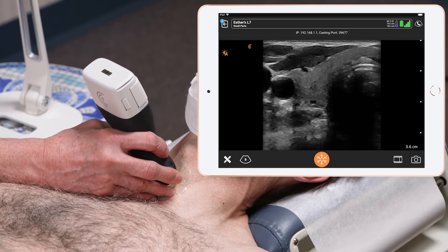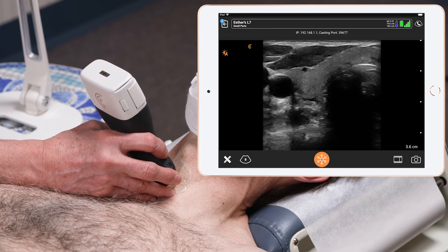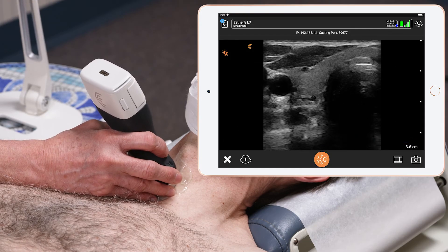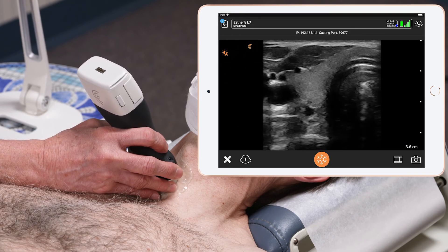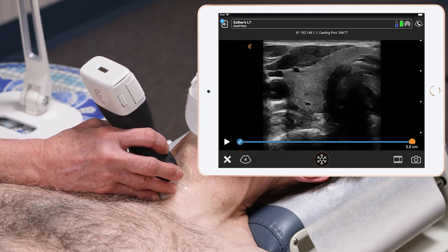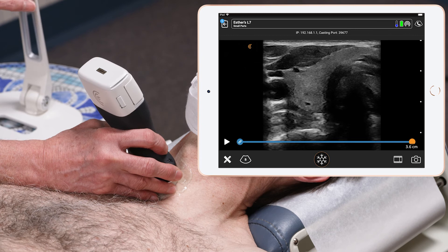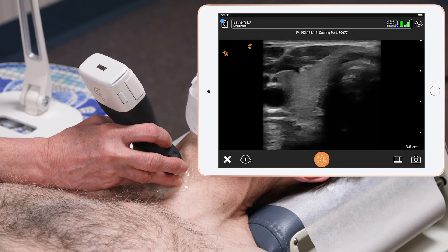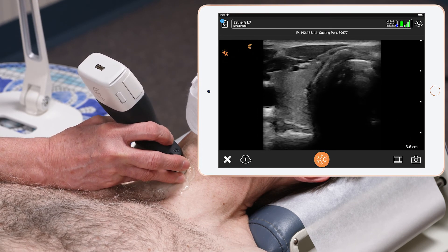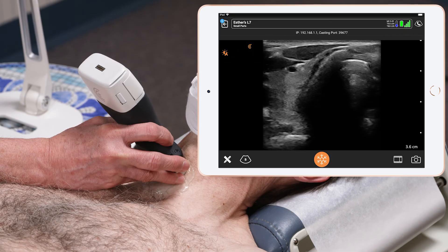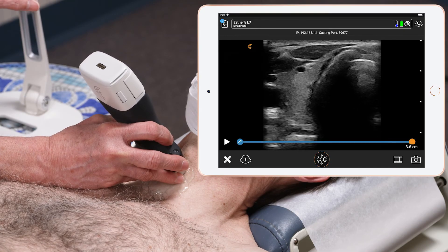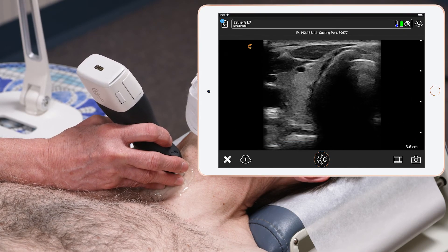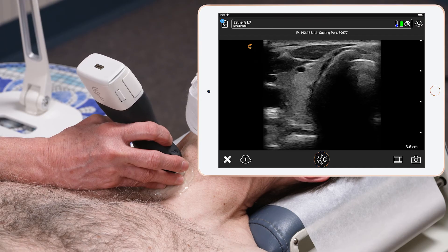Once I find the inferior portion of the thyroid, I take a picture, I move up to the mid and record a picture, and then I scan to the superior portion of the thyroid — that will be the final picture of the right side of the thyroid.